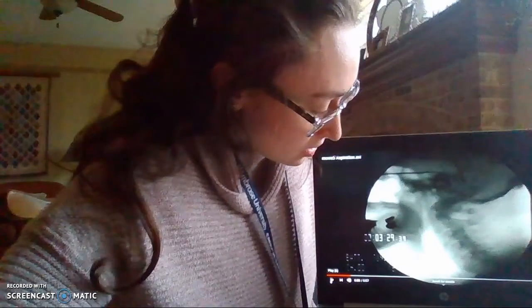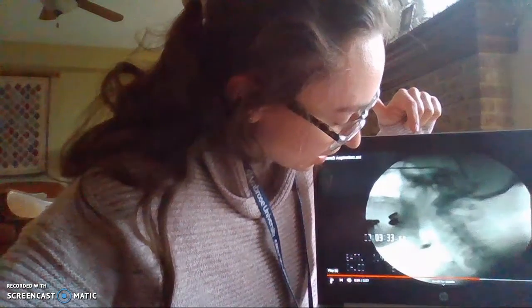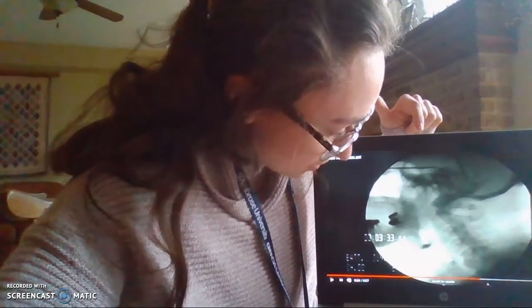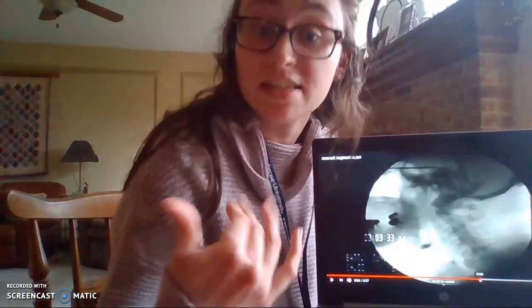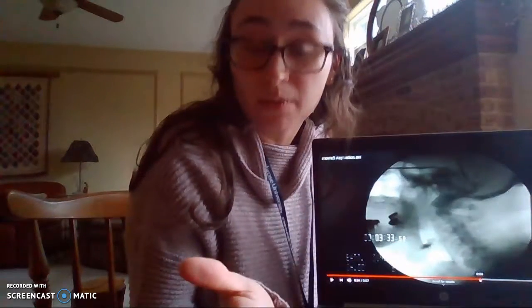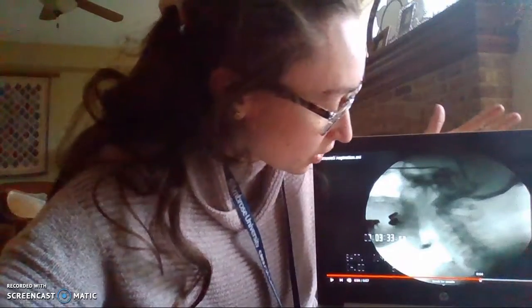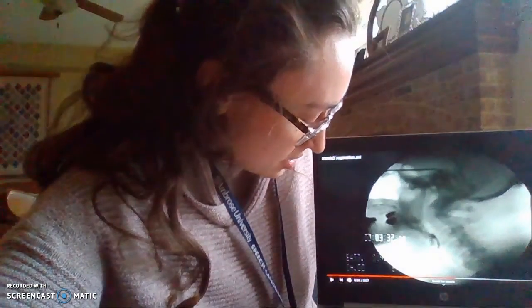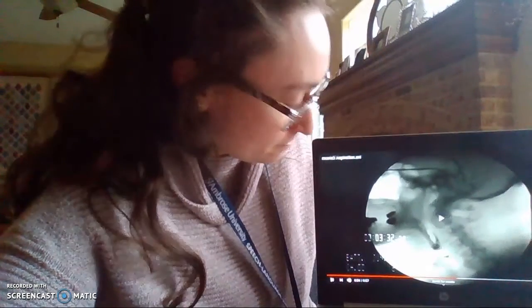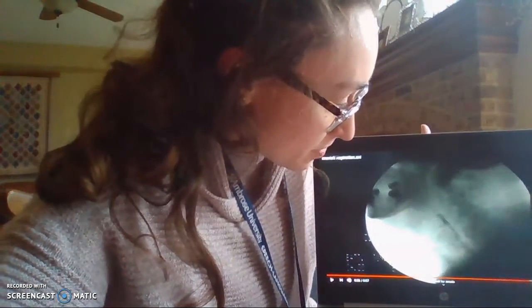So you're about to take a sip, and it goes down, and you can see, we'll rewind a little bit, that most of the liquid that you swallowed did go down safely, the esophagus, that food pipe, but there was a little drip of that bolus of that liquid that did go down the airway, the trachea. So we'll take another little peek at that. We'll rewind right here. It goes pretty quickly. Yeah, so we see that little drip, and we'll replay this.